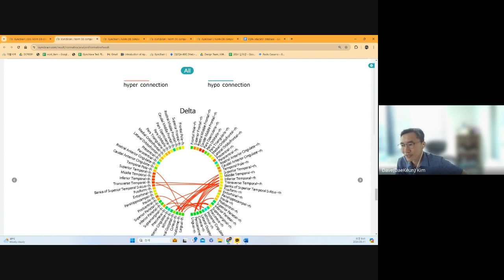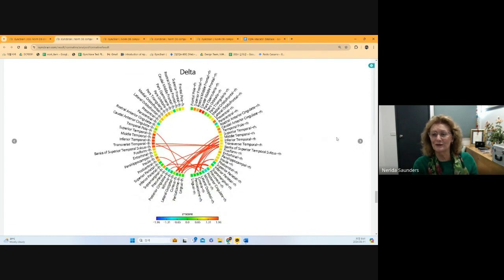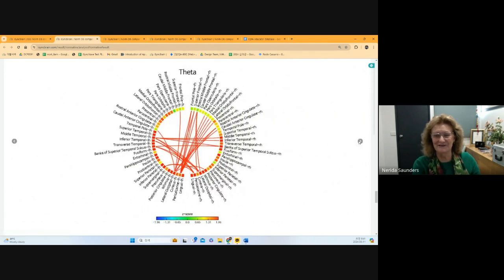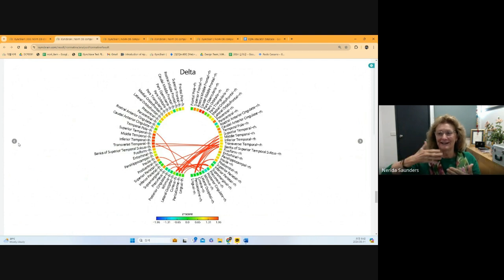this connectivity, I have to ask the doctor about her history. I need to check the patient history, whether she had a head trauma, but it could be, I think. By the time you get to be old, you've bumped your head many times. I just wonder if a lot of our dementia presentations don't relate to years of many bumps to the head as well.